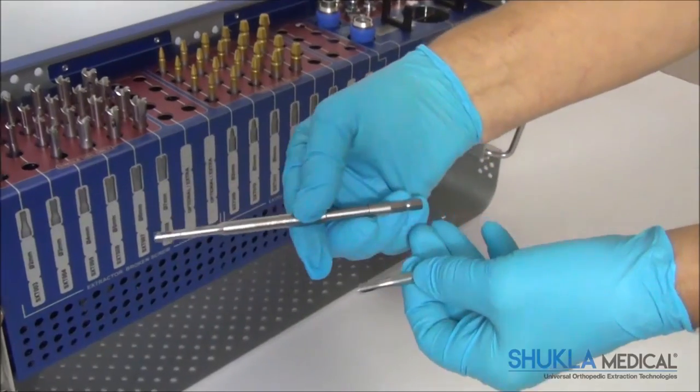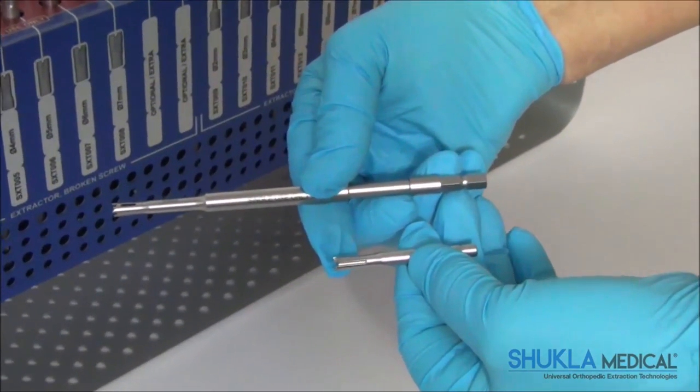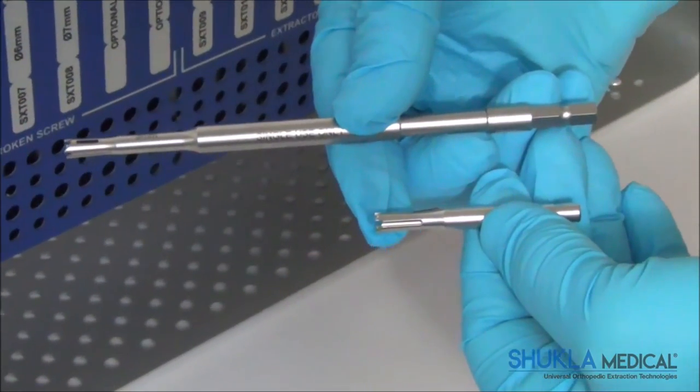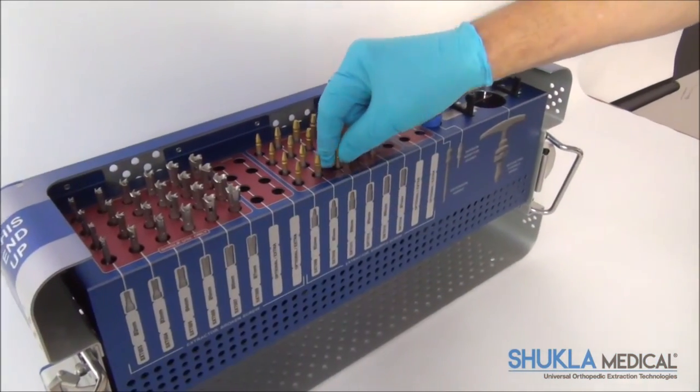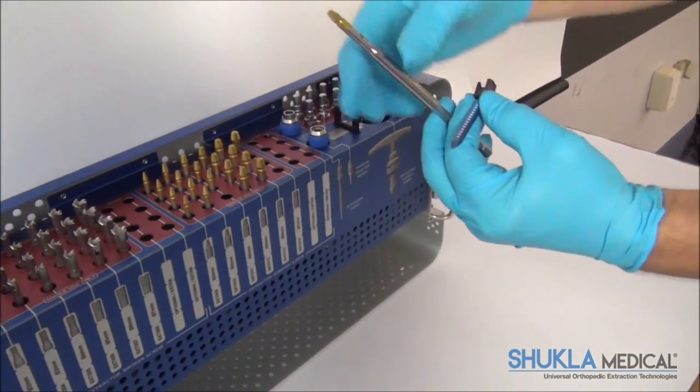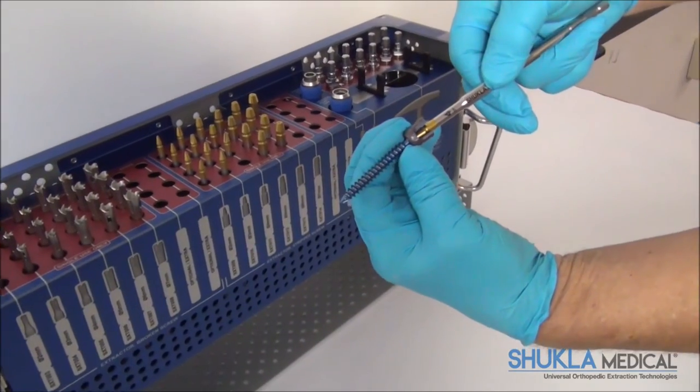For better visibility, the extractors are 10cm longer than the current extractor screw extractors. The stripped screw extractor tips are more narrow to allow the surgeon to gain access in between the saddles of the pedicle screws.